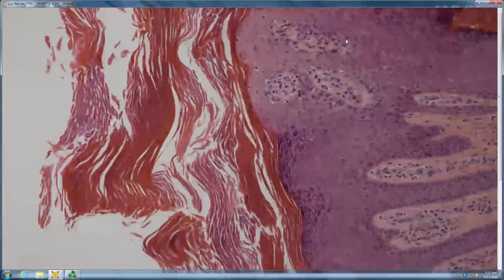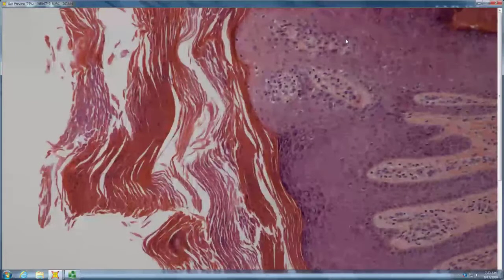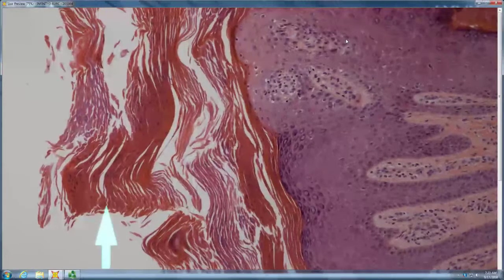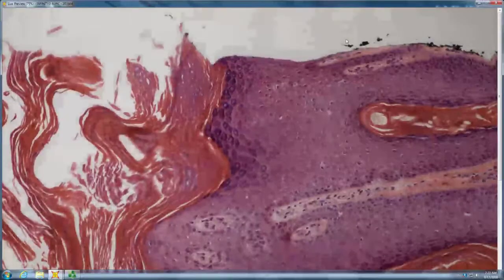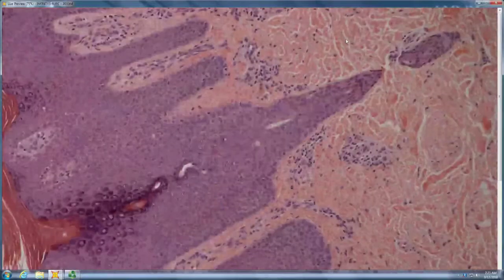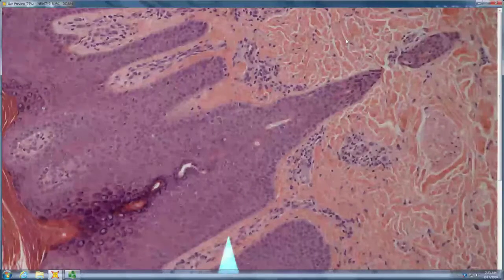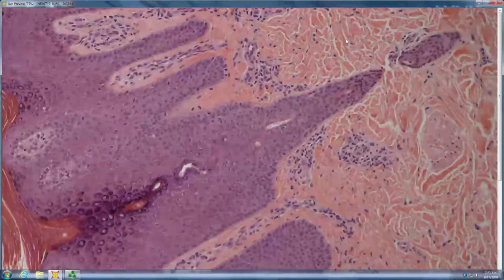Let's see. The suprapapillary plates are kind of thick. You are almost correct. Looks like PRP again. Yeah, so again, you definitely have an alternating checkerboard pattern, more accentuated around the follicles. There's follicular plugging. This is definitely rubbed or scratched PRP. PRP is often pruritic, and you definitely have some superimposed LSC type changes here. And that's exactly what it was, pruritic scratched PRP.